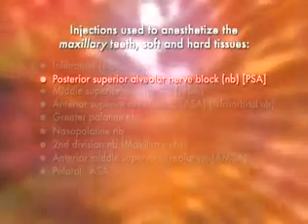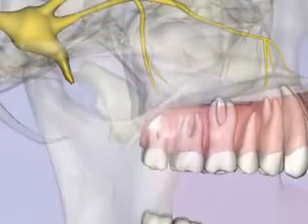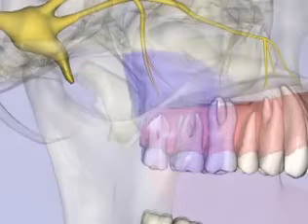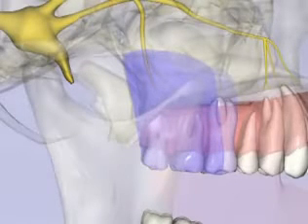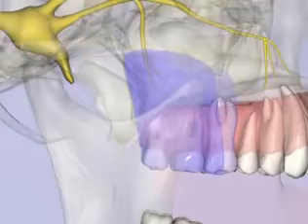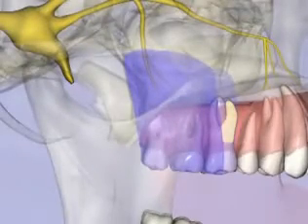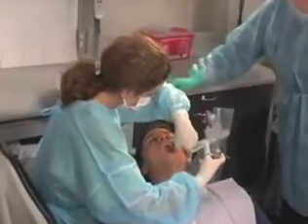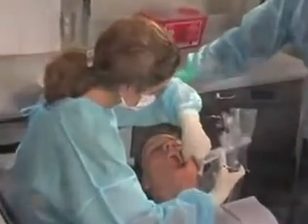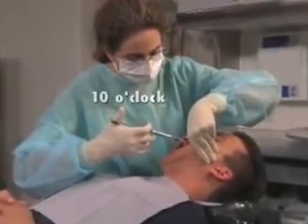The posterior superior alveolar nerve block provides pulpal anesthesia to the three maxillary molars and the supporting buccal soft tissue and bone. In 28 percent of patients, the mesial buccal root of the first molar may not be anesthetized. A 27 gauge short needle is recommended. For the left PSA nerve block, a right-handed operator should sit at the 10 o'clock position facing the patient.